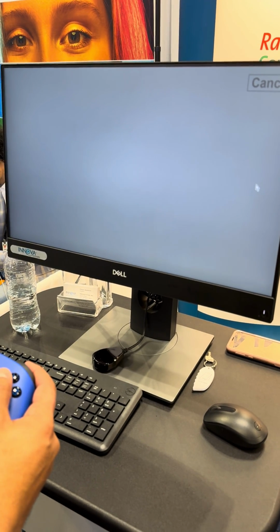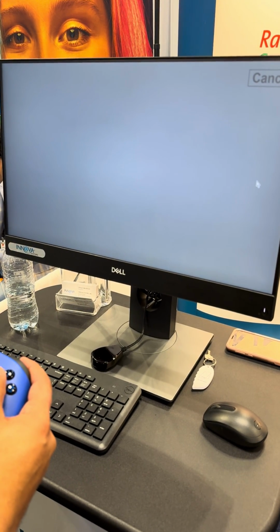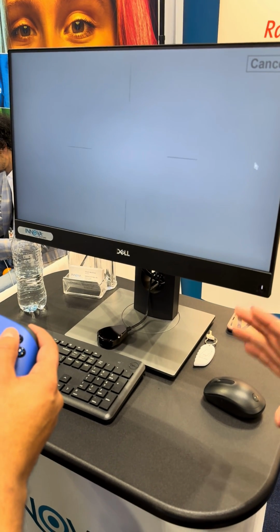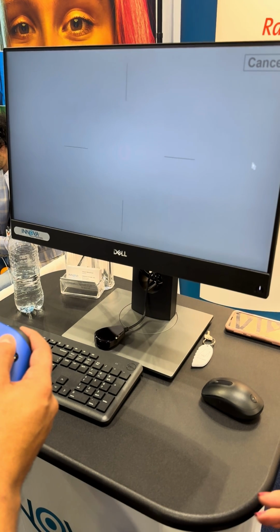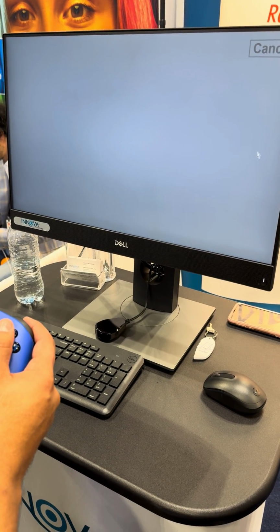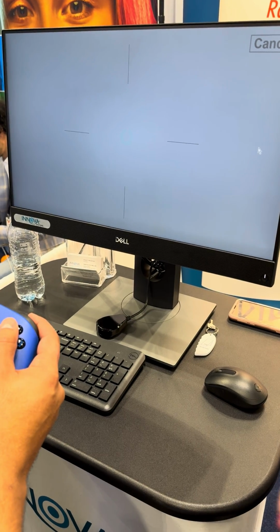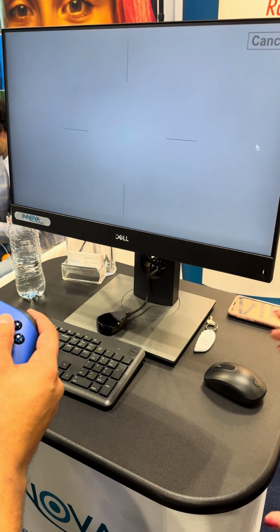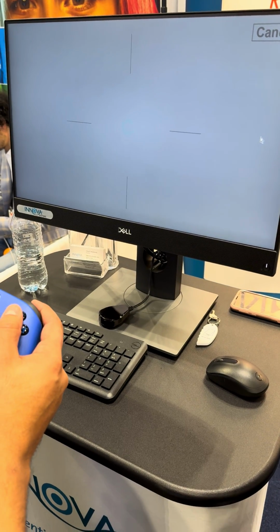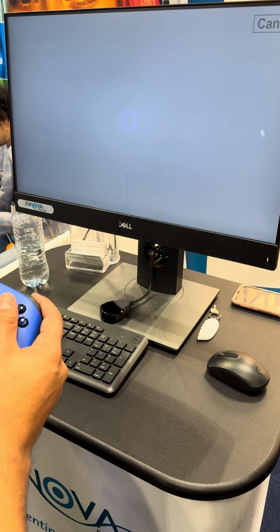But you can see we're going to threshold. We're reducing the contrast for each cone type. We're measuring them independently, so it's very different than a color confusion test like an Ishihara or a D15, which is more of an arrangement. We're actually measuring the individual cone function. With that, we can produce a score. You can use that for progression over time.